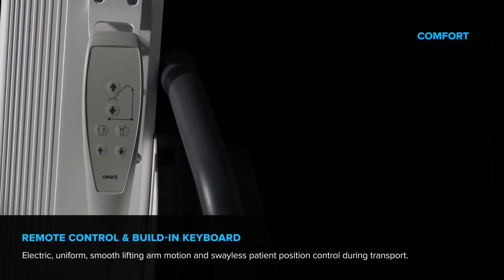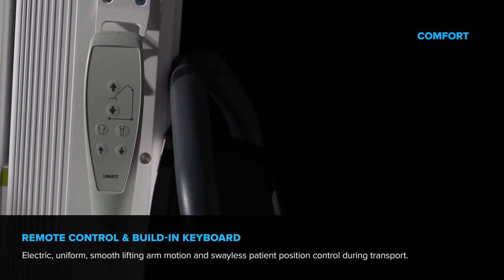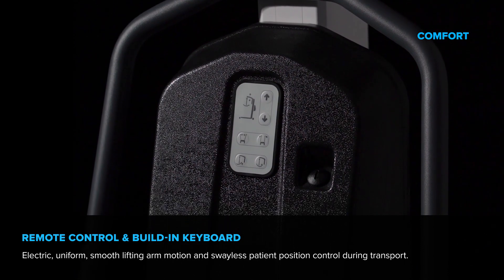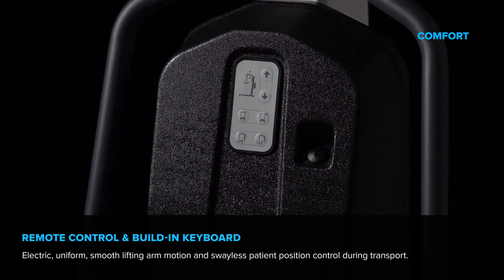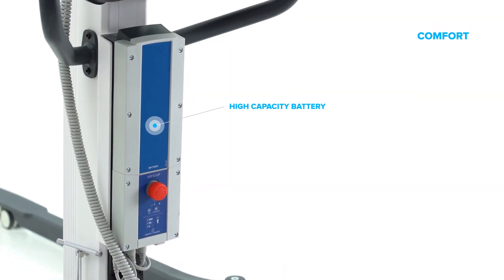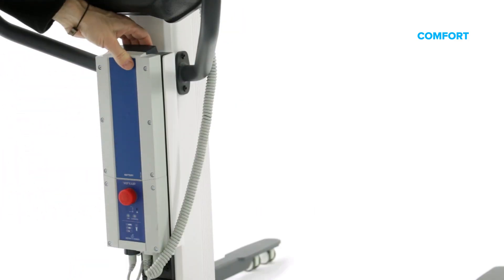Intuitive operation via remote control or built-in keyboard. Electric, uniform, smooth lifting arm motion and swing-less patient position control during transport. A capacious battery allows many lifting and lowering cycles without the need to recharge. Emergency stop button included.